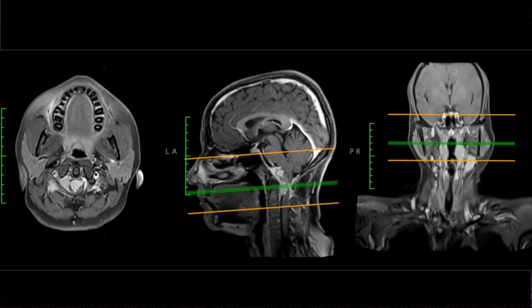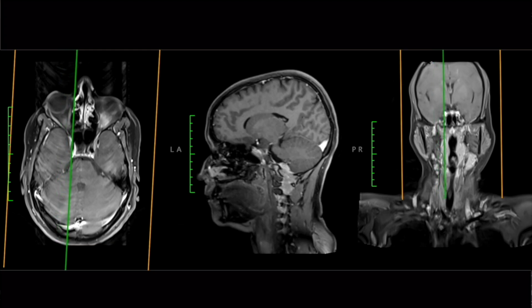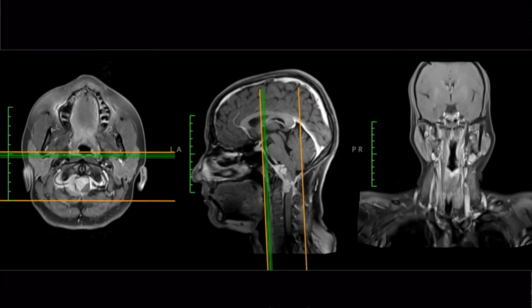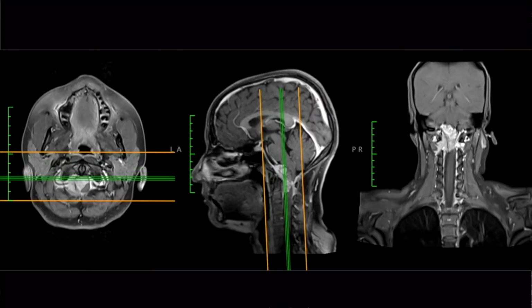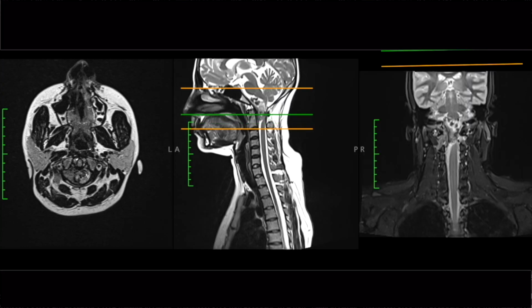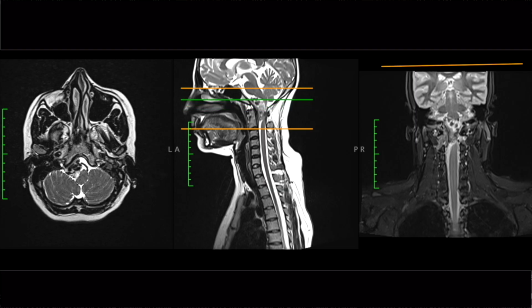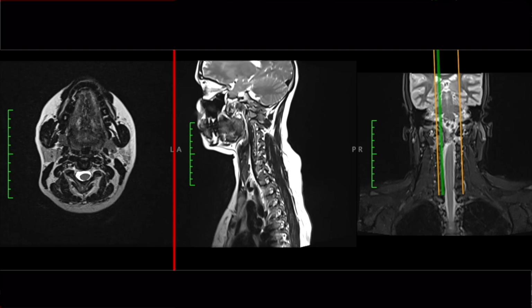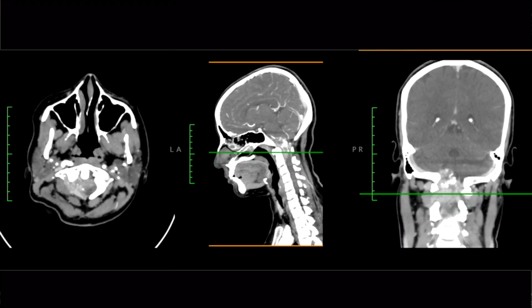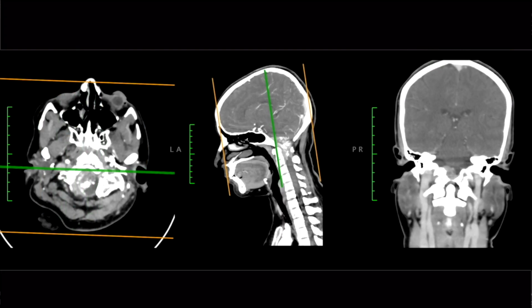The preoperative imaging was suggestive of a heterogeneously enhancing extraaxial dural-based lesion spanning across the right side of foramen magnum and reaching till C2, approximately 4 x 3.6 x 3 cm, causing significant compression on the cervico-medullary junction. The extradural extension was noted inferiorly and laterally, involving the posterior arch and the lateral elements of C1 and C2 on the right side without bone remodeling or erosion. The angiogram was suggestive of narrowing of V3 and V4 segment of right vertebral artery with encasement of right PICA.